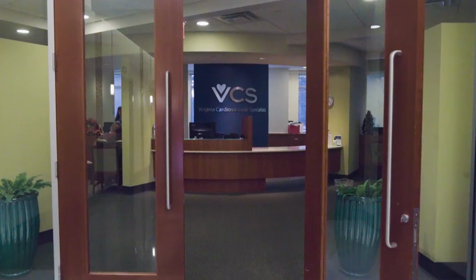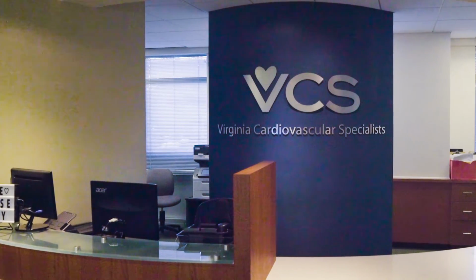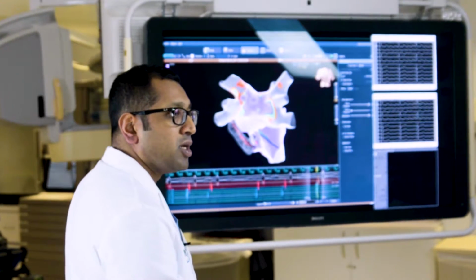We do coronary CTAs for patients with chest pain, so that's looking at coronary arteries, let's see if there's any high-grade coronary artery disease. We also do studies that help support our structural heart programs, planning for procedures such as TAVR, which is the new transcatheter aortic valves, and for our electrophysiology colleagues, ahead of EP ablation studies, they like to get CT imaging for that as well.